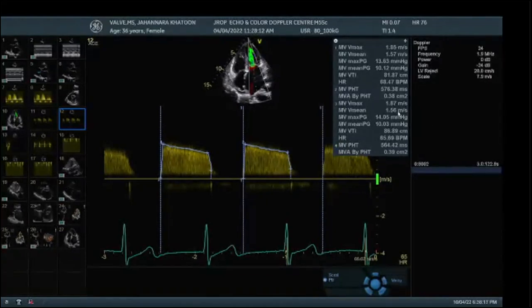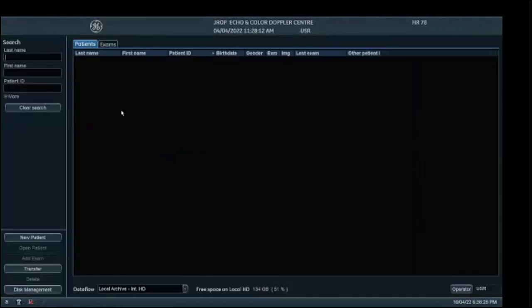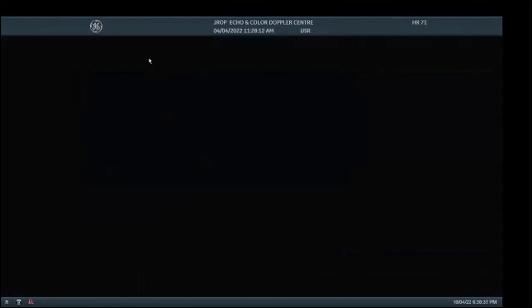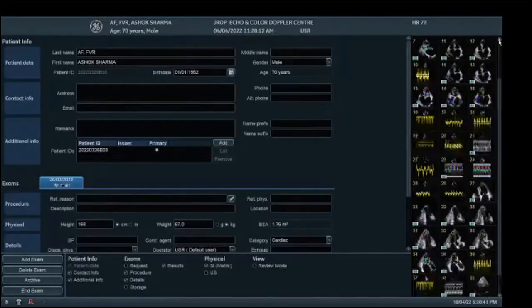And in healthy patients, sir, how would a healthy patient look, if there are no stenotic gradients? Suppose a healthy patient is in atrial fibrillation, right? I'll show you a healthy patient in atrial fibrillation. This is non-valvular atrial fibrillation. Just give me a second.